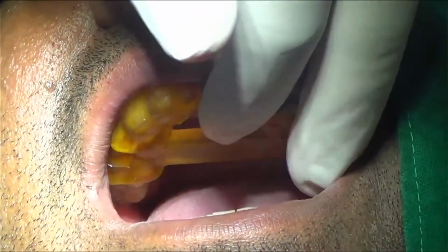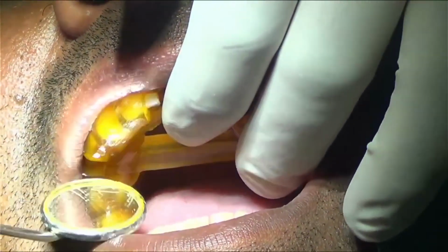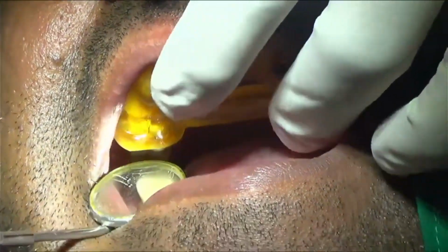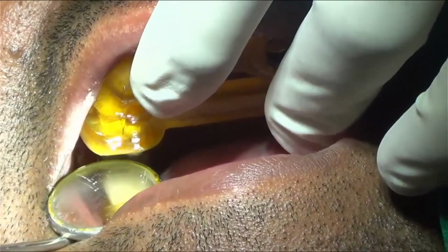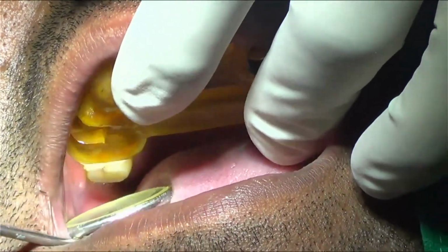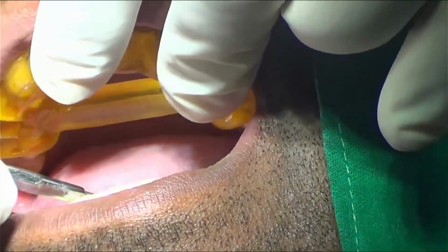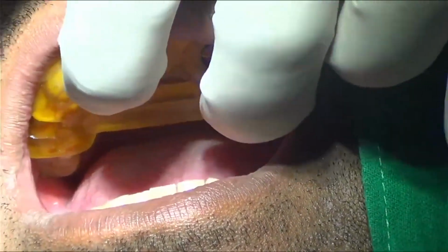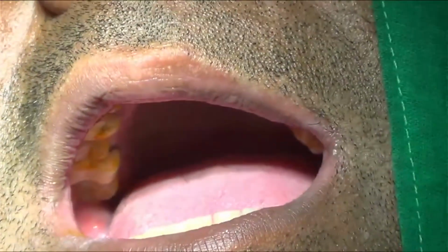And mirror, please. And second, we have to take the mirror on the distal aspect of where the guide is ending, and then we have to check whether there is any gap or not. In this case, there is no gap seen in the surgical guide. Similarly, we can check for the others also.